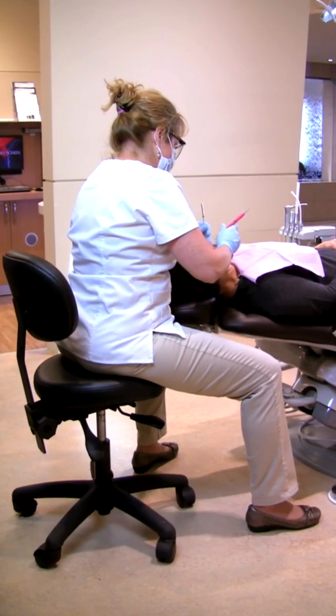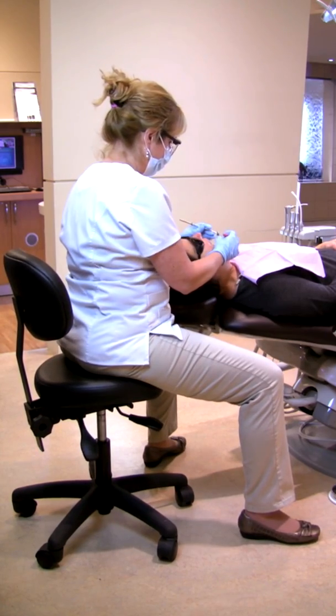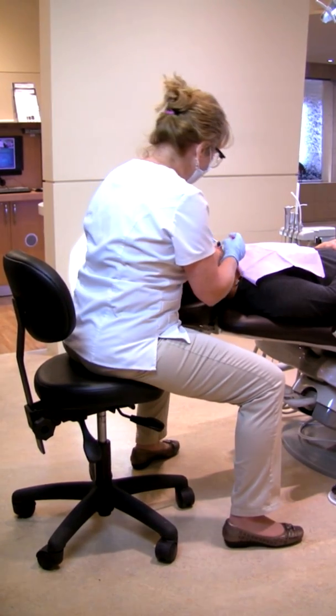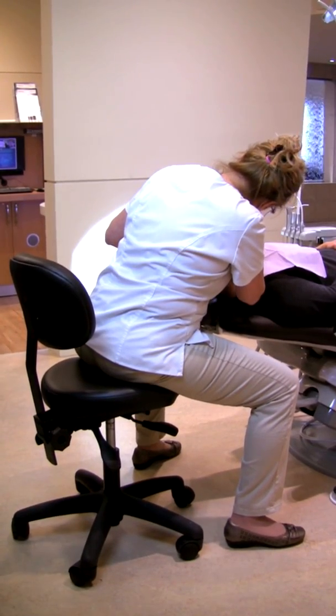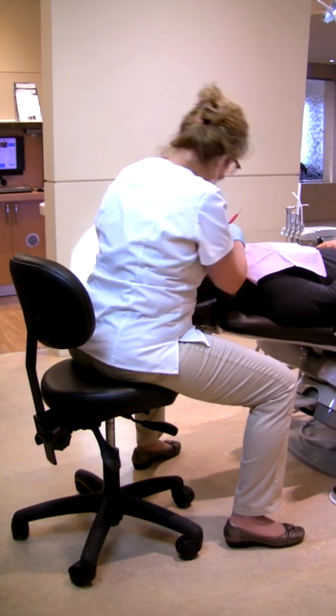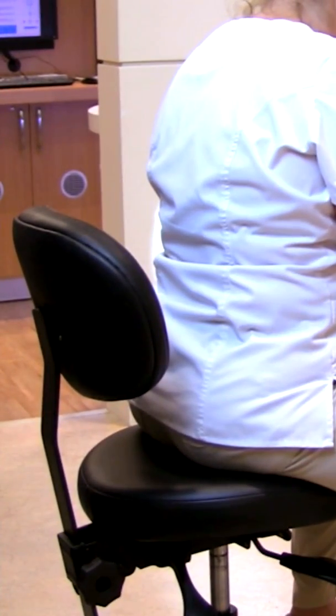The low position of the patient's chair provokes considerable flexion of the neck muscles. Lack of sufficient leg room also causes the dental worker to sit on the edge of the seat, legs spread wide. This ill-fitting posture transfers significant pressure on the lower back and denies the operator the benefits of proper lumbar support.